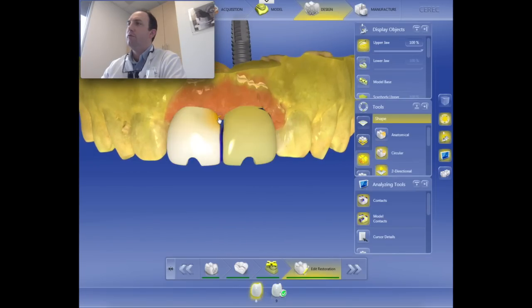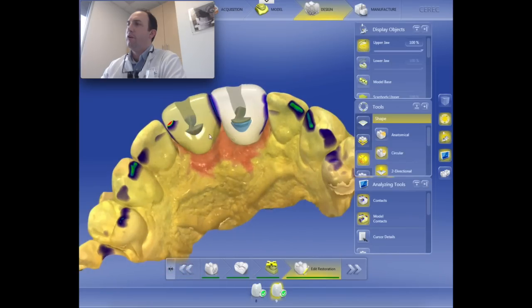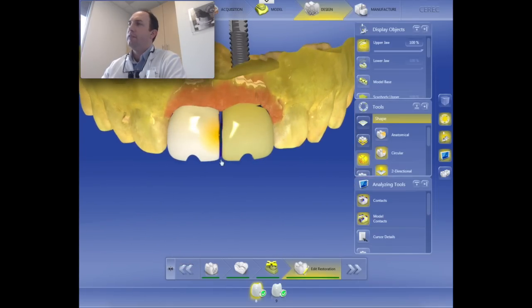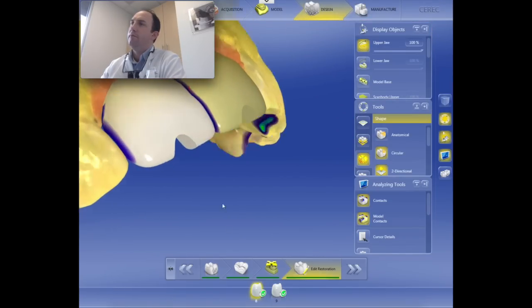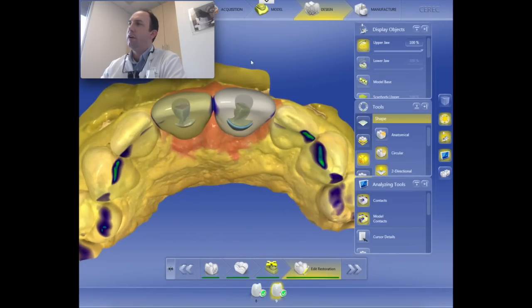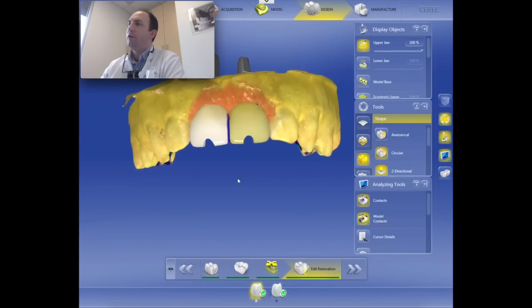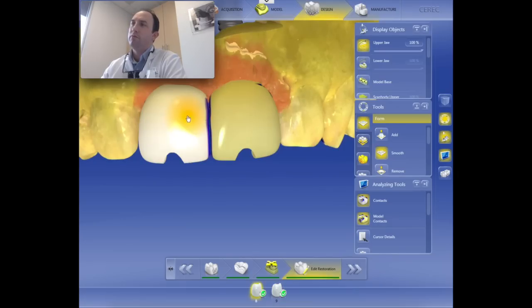I'm going to use my circular shape tool a little bit more. Chances are really good that if I design this pressure appropriately, we can actually have the gums pressed into that dark little triangle we're seeing along the gingival line, without strangulating them. Oftentimes when we're doing this, I'll make sure that I prepare my patients for the fact that you may need to be numbed when we're delivering these crowns. There's a very real chance that this could hurt. If it does, I want to know. We'll get you numb, because we're going to be intentionally sculpting that gum tissue with the crowns, which requires pressure to do that.